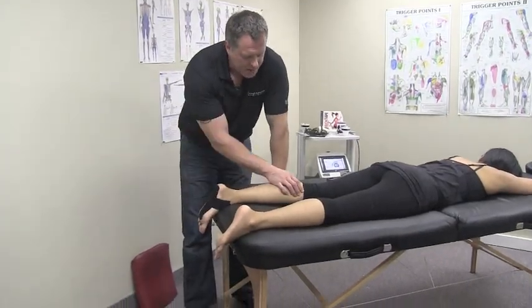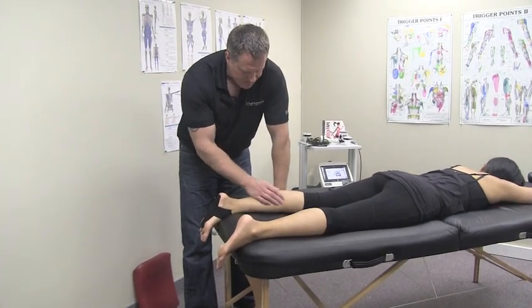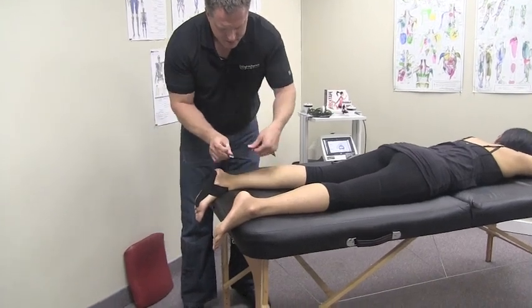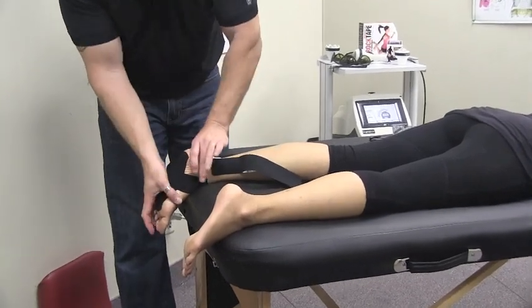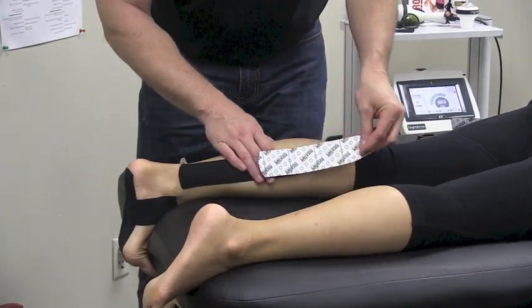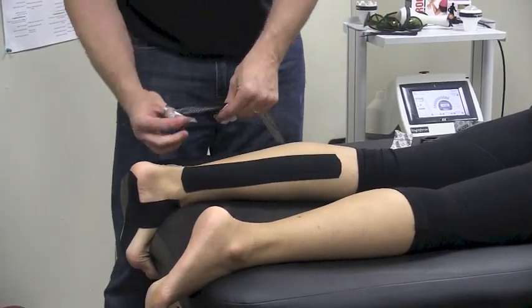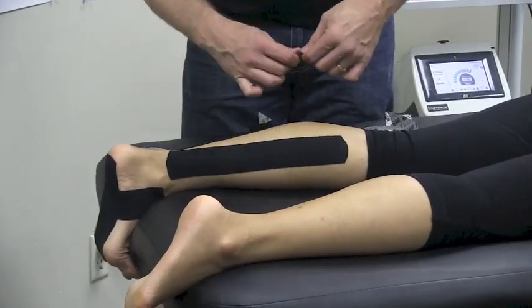With plantar fasciitis you'll always have involvement of the gastroc and posterior muscles of the calf. I'm going to show you how to tape that using two strips. Tear back the anchor point and anchor on the side of the calf. Lay down the anchor, stretch the calf by dorsiflexion, and lay the tape right up the side of the calf and gastroc. Rub it down to activate the glue, then go on the other side of the Achilles and do the same thing. You can put the decompression strip right in the middle on the soleus.